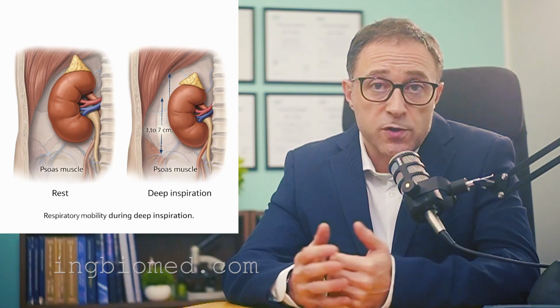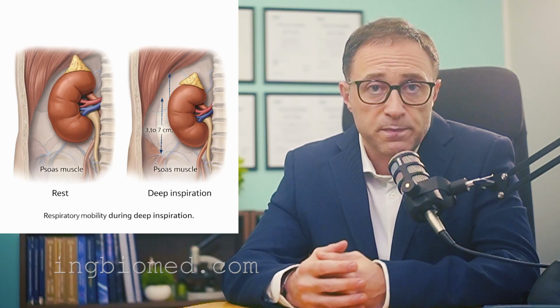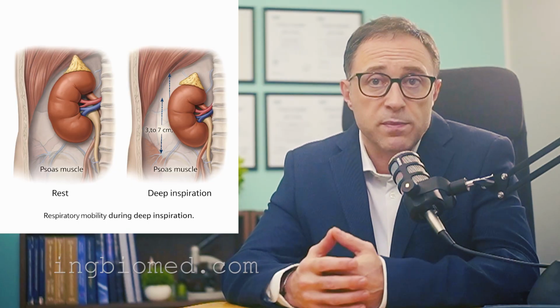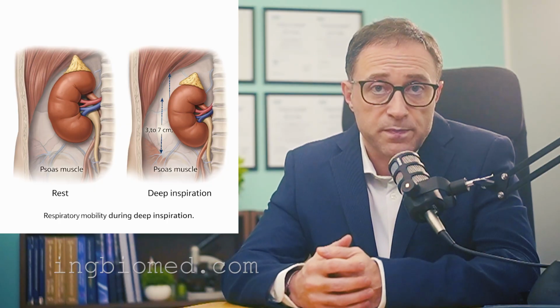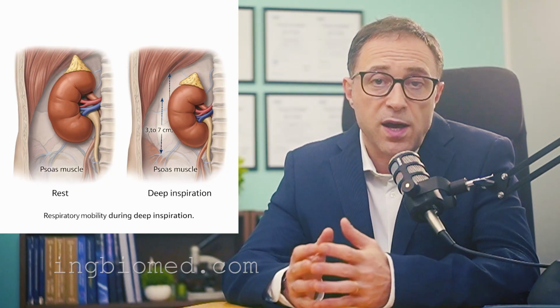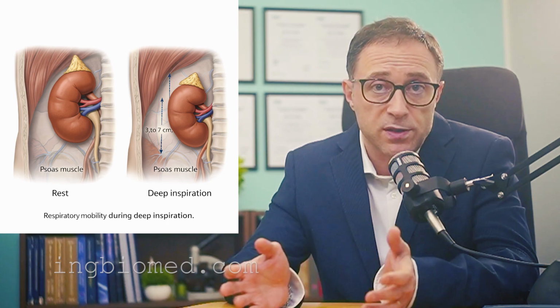One important physiological feature is respiratory mobility. During deep inspiration, the kidney moves caudally along the psoas muscle by approximately 3 to 7 centimeters. This movement is useful. It improves the acoustic window and helps distinguish fixed retroperitoneal masses from the kidney itself.